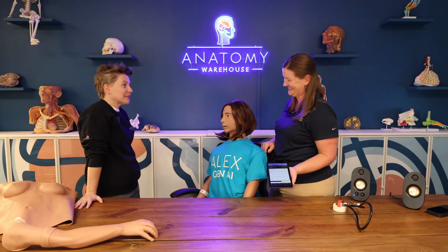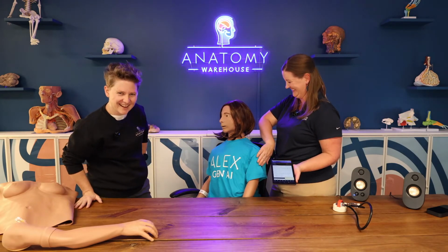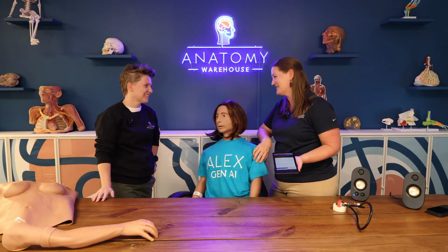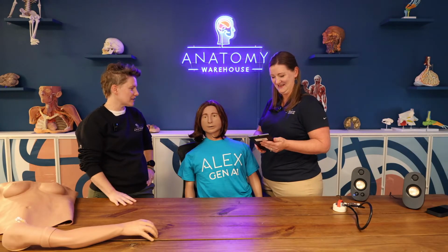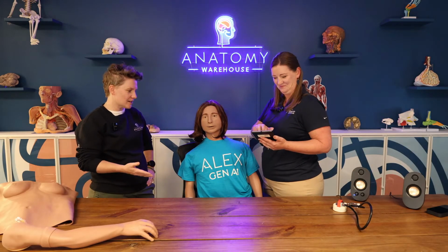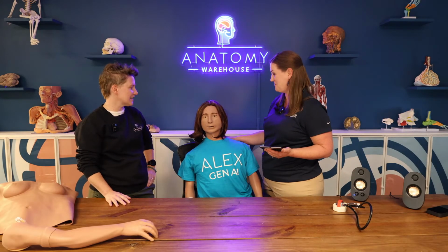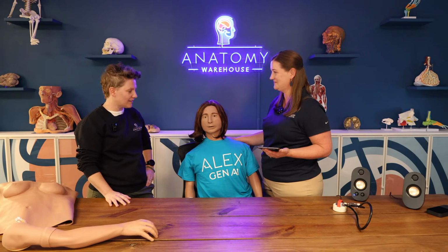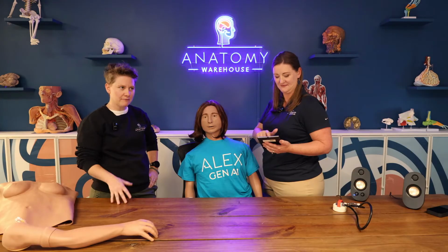Do you have any other clinical questions for her, Melissa? No. I probably shouldn't ask her those questions, but I just think this is so cool that you can have a real conversation, and the conversation flows naturally. We've not practiced any of this, and it's really interesting to see how you guys are integrating AI into the mannequins in a way that feels authentic and you can have a real conversation.